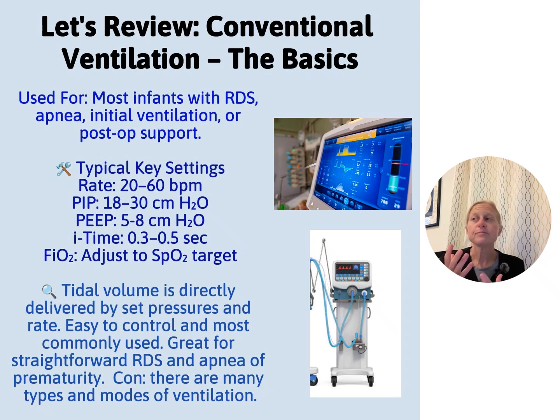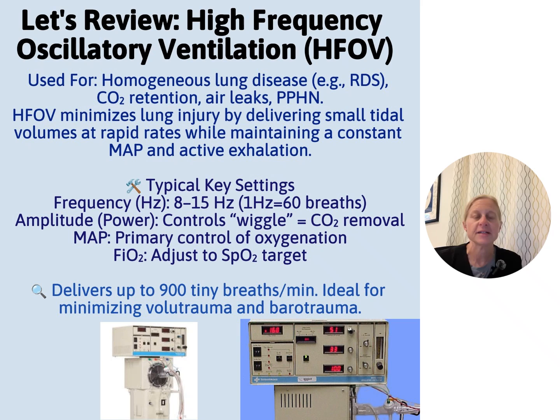And so the con of the conventional ventilator is there are so many different modes, and figuring out what exactly works best for the patient you're taking care of can be tricky. That's why we rely heavily on our respiratory staff and our experienced providers to help us decide, hey, what should we be trying next? So use them as your resources.